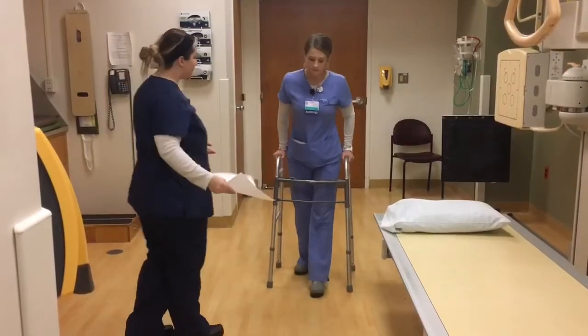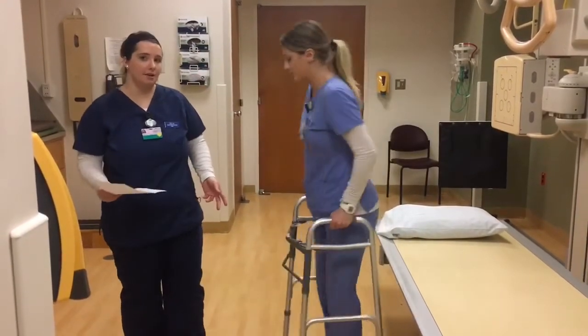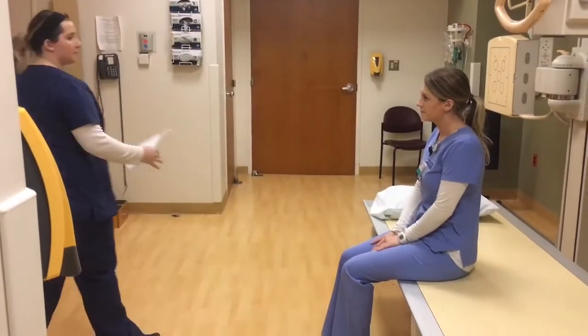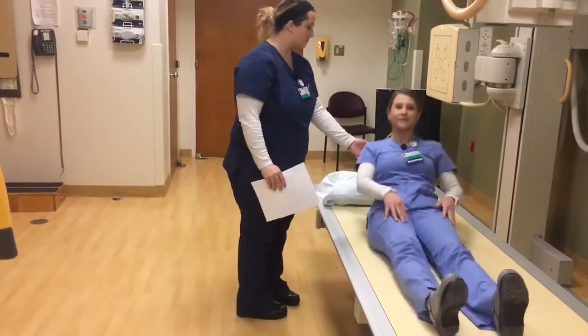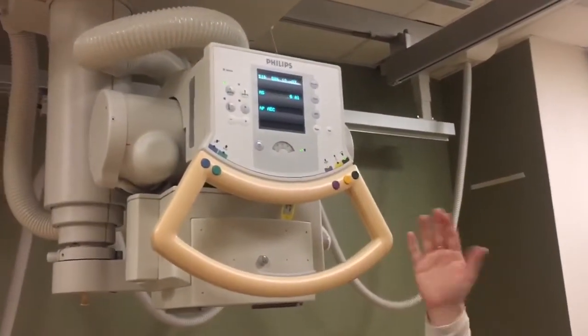Shannon, I'm going to have you take a seat right on my x-ray table. I've already confirmed my patient's name, date of birth, and if there was any chance of pregnancy. Shannon, what leg has been bothering you? My right leg. Okay, I'm going to have you lean back. You can lay your head right back. Okay. Now I need to put the tube into both detents.